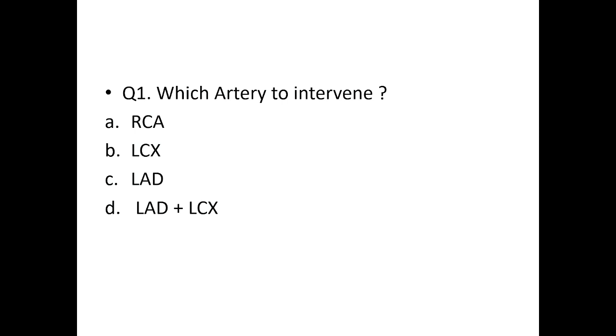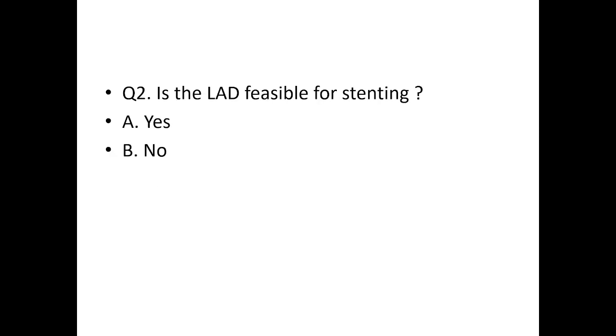There was a tight lesion, and plaque rupture produced the acute occlusion, but still the RCA is giving the supply. So this is not a CTO, and we plan for PCI to the LAD. By definition, your LAD is not a CTO. Not a CTO, sir. Yes, sir.